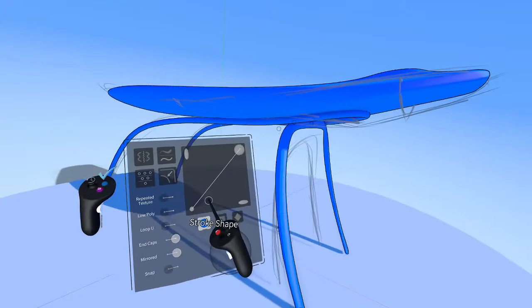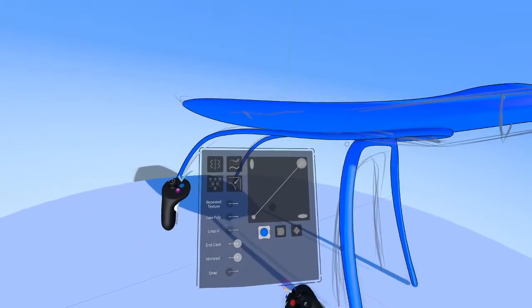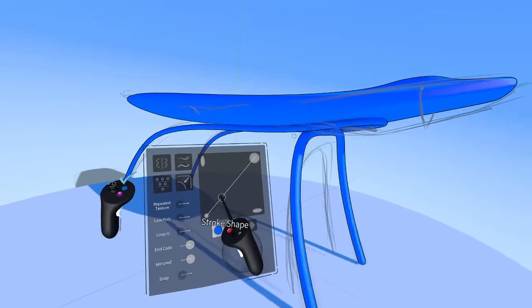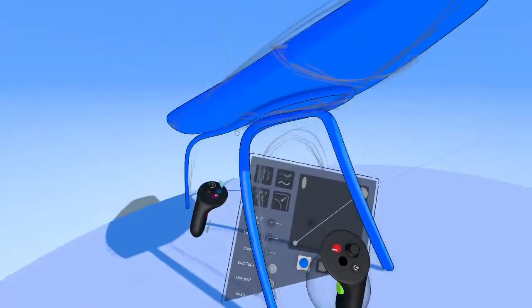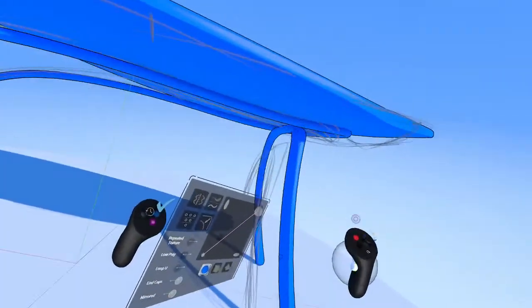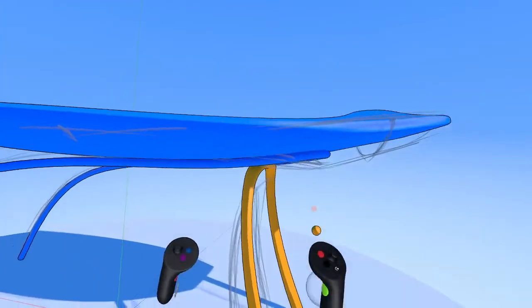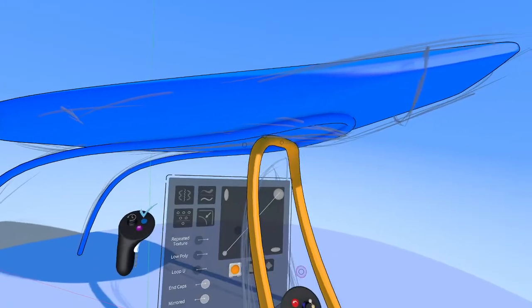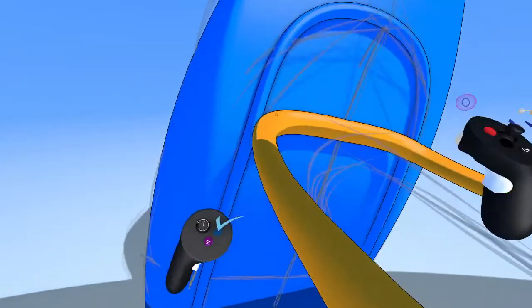So here, now that we have it in edit mode, we can take a look at the panel on our left-hand controller. We have this graph, and we can actually change the shape type of this as well. So I'm going to give it more of an oval shape like this, and let's color this differently so we can separate it from everything else we're looking at. So again, in edit mode, if you see, that oval shape is traveling in a different direction as we progress through the curve here.